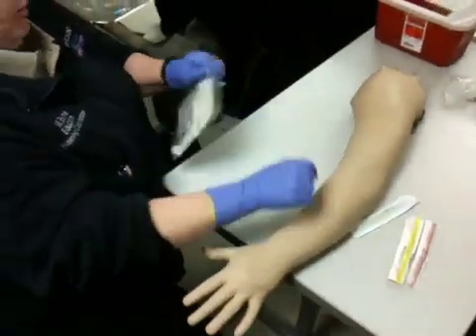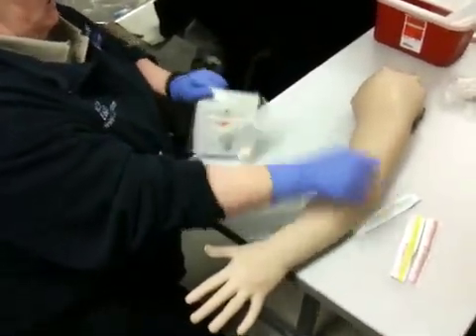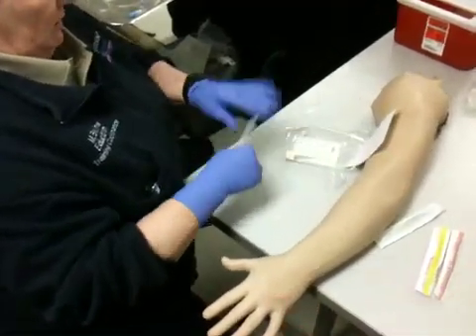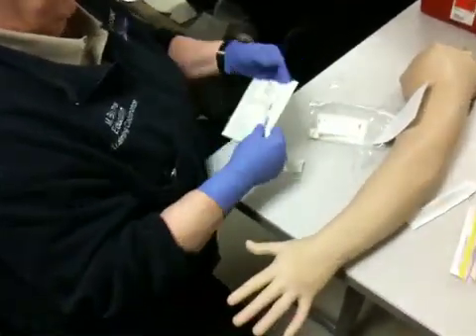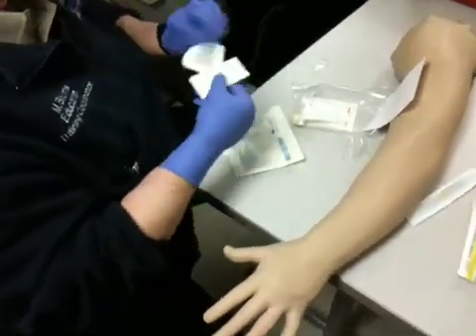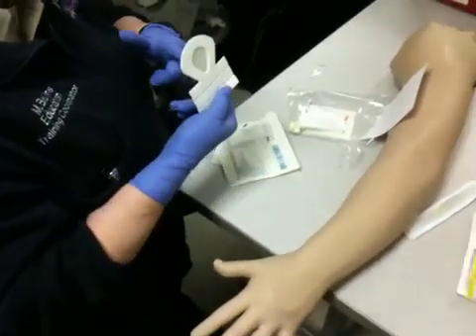Now, here's the whole process. Let's look at how it all comes together. First of all, you have what we call a little op site. This goes over the area where I have stuck the catheter right here.